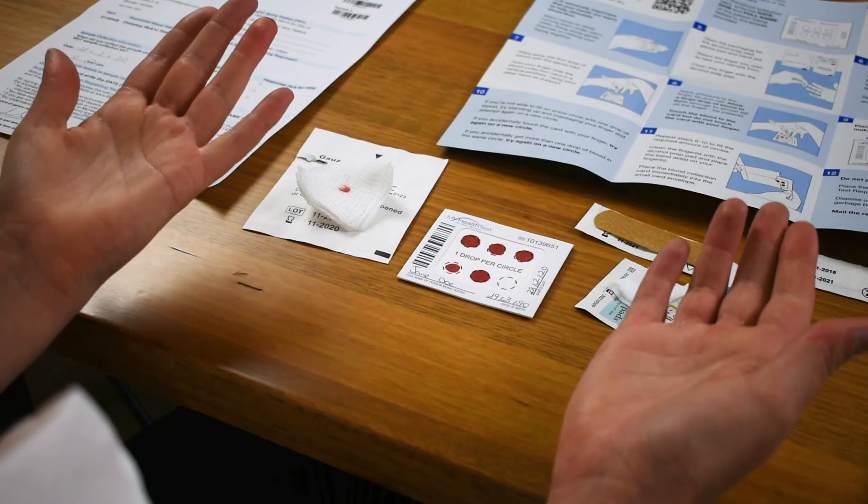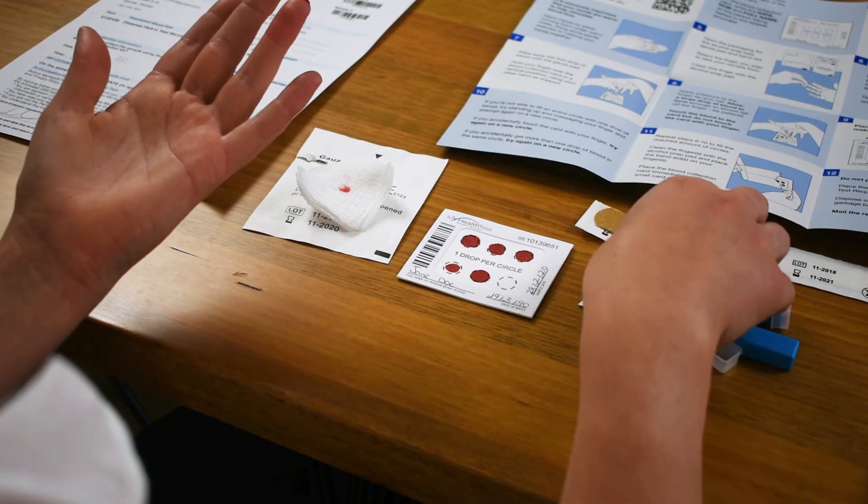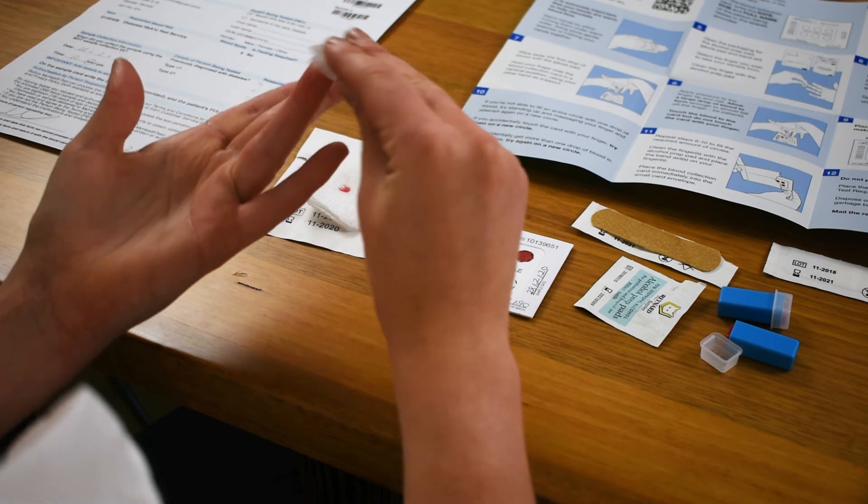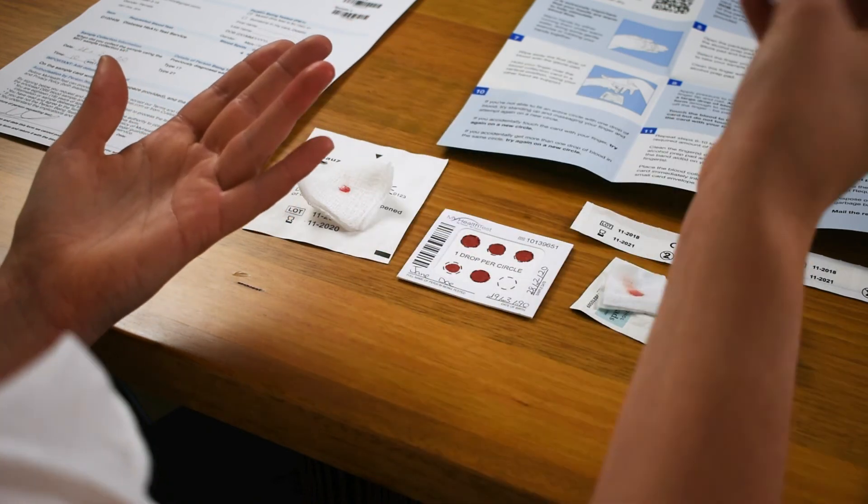Once you've completed the number of spots required, pick up your alcohol wipe, clean the end of the finger again, and get your band-aid ready to put on your finger. If you're having trouble with blood flow and haven't filled the required number of circles, don't be afraid to try your second lancet on another finger — often the blood flows a lot better from another site.